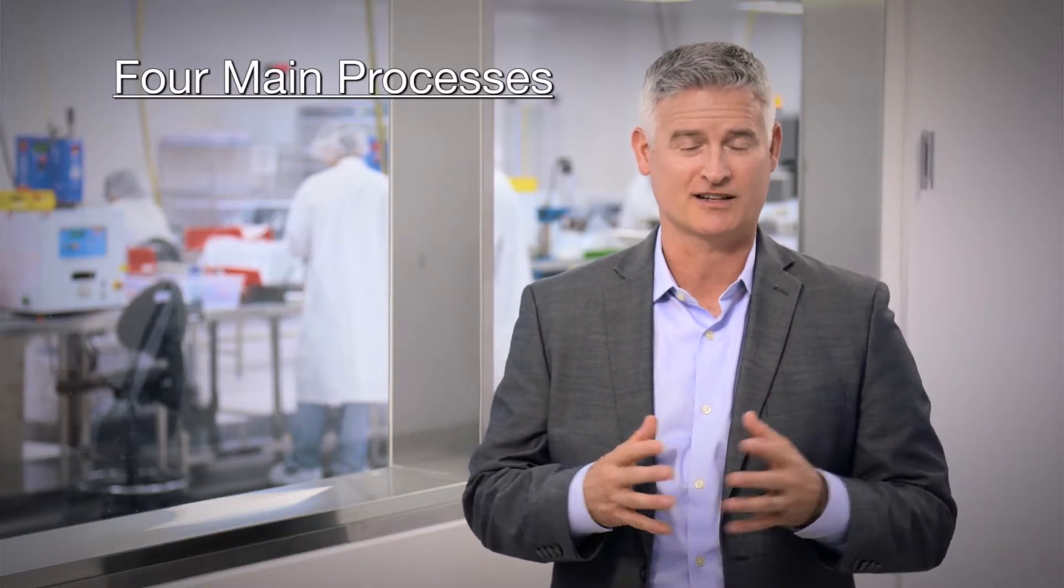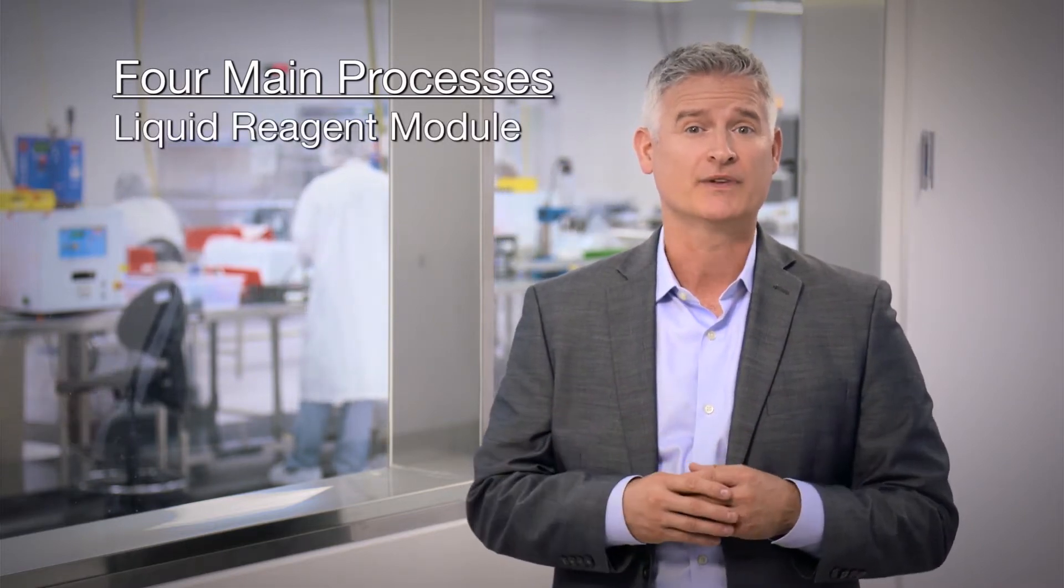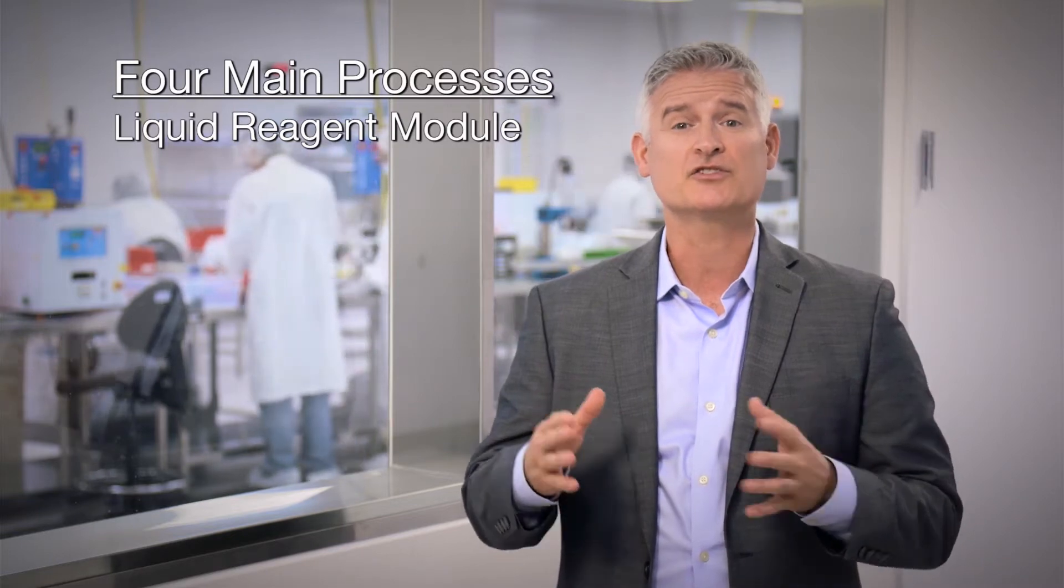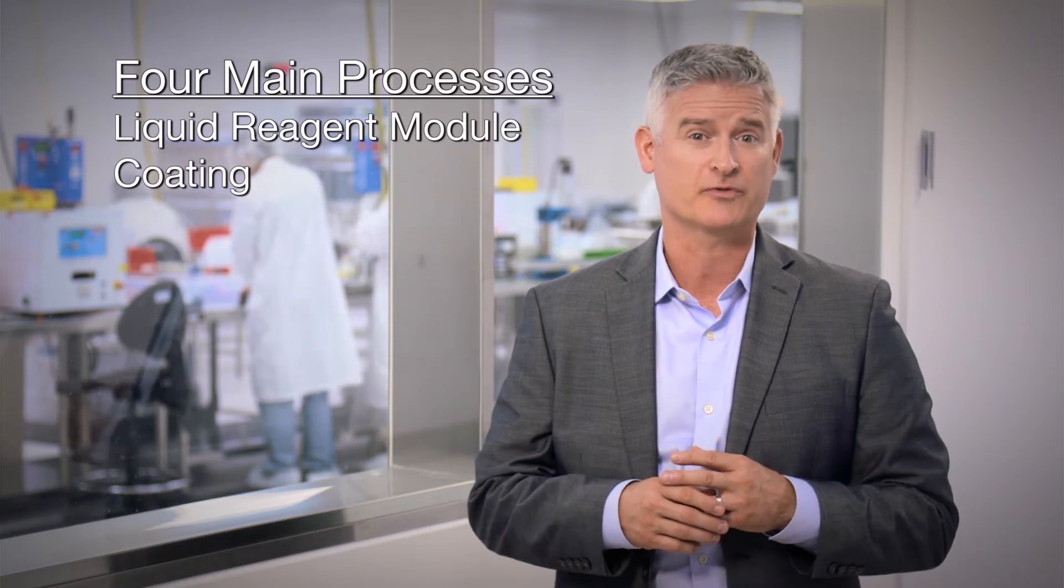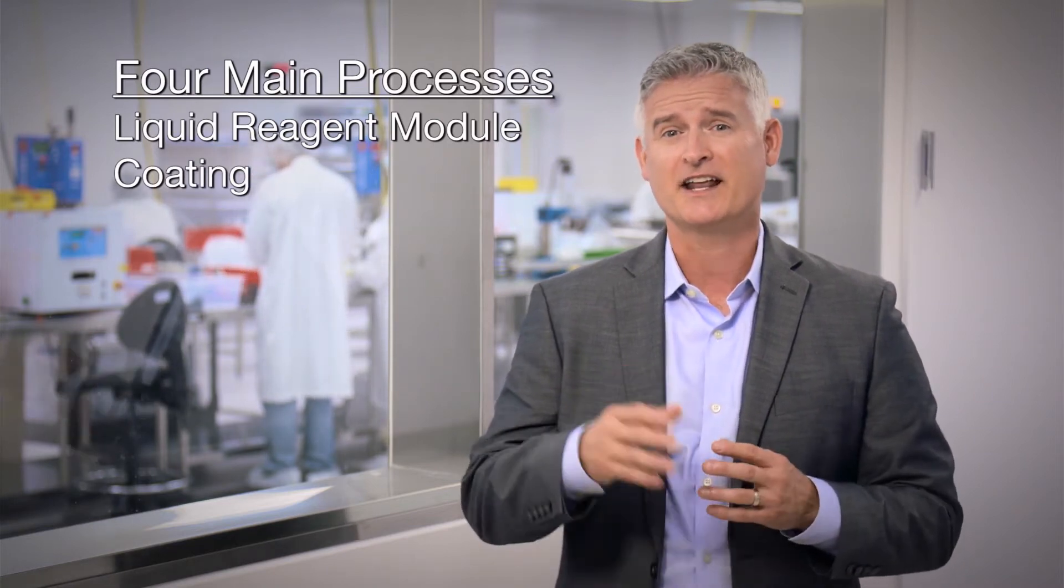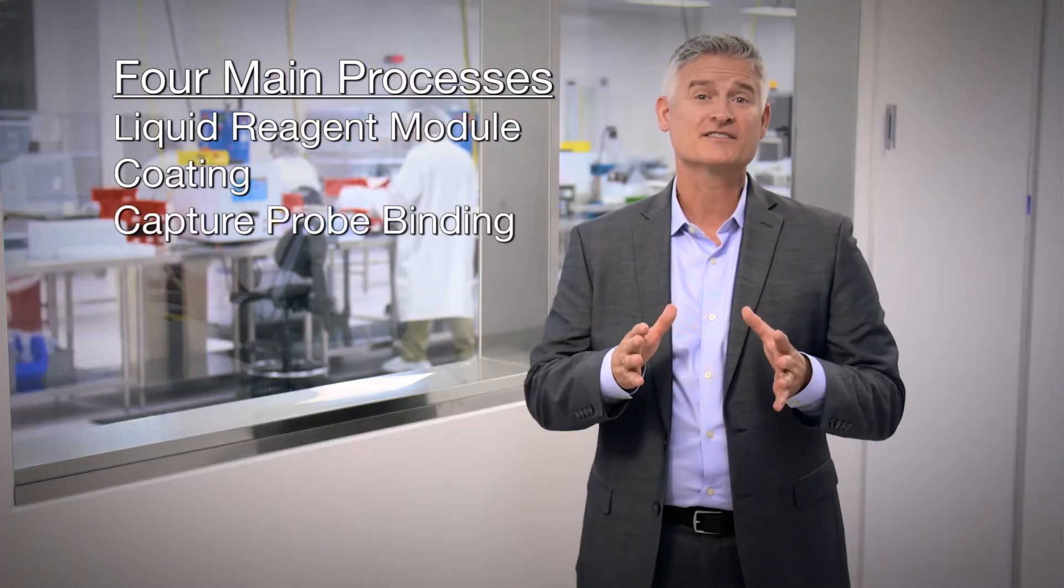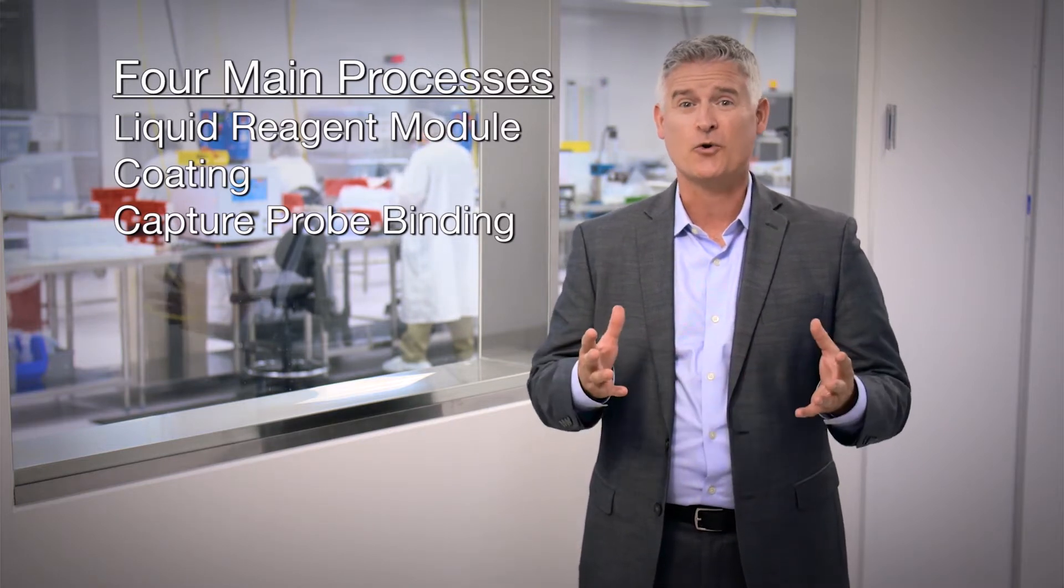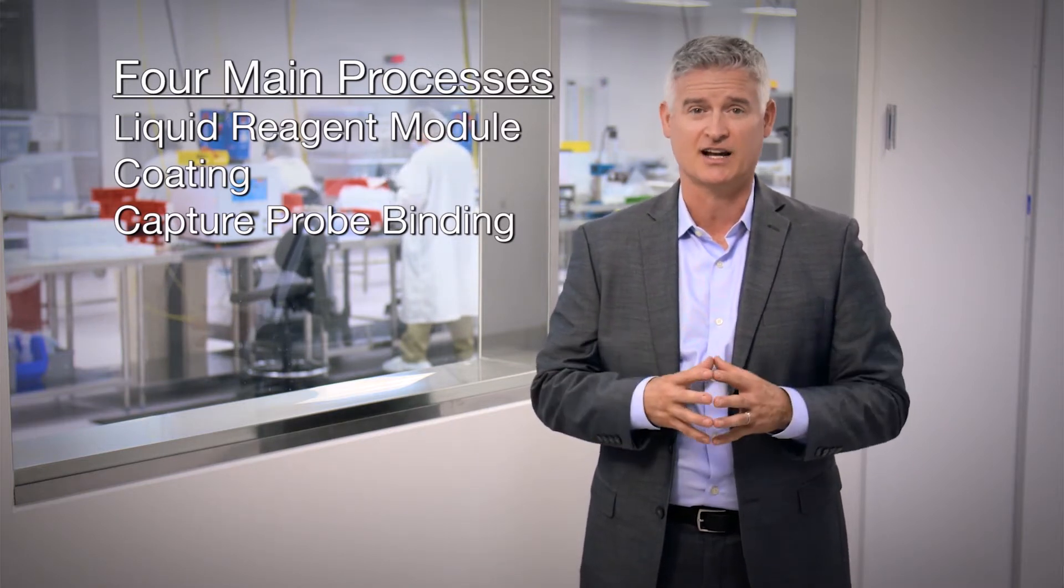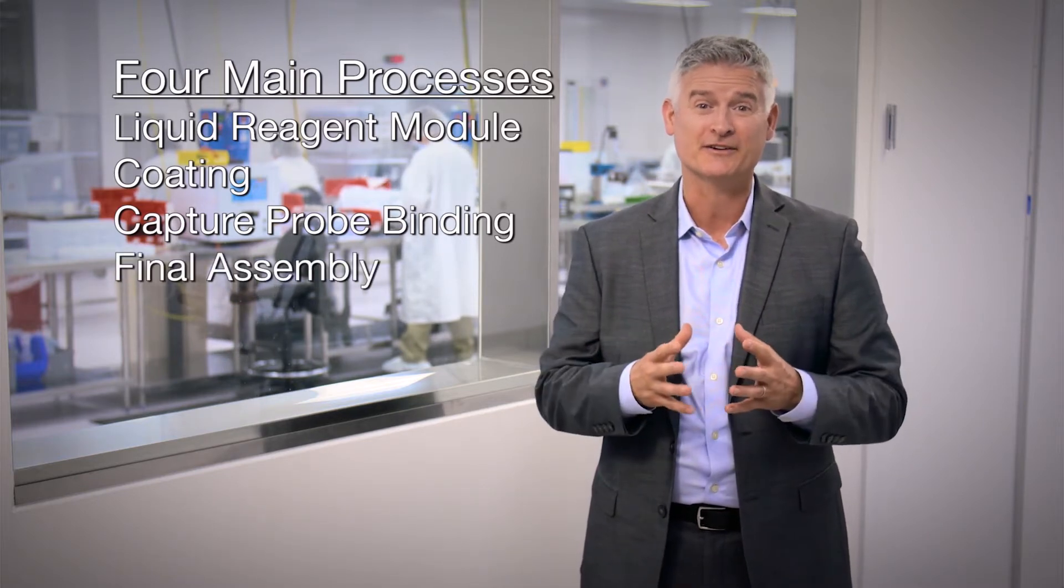As part of our tour today, we'll highlight four main subassembly processes. First is assembly of our liquid reagent module or LRM, that contains the liquid reagents used in all of our assays. Second is the coating of ePlex cartridge components for the Electrowetting Microfluidics technology that enables ePlex's sample-to-answer capability. Third is the binding of capture probes onto the electrodes of the printed circuit board, that is the core of Genmark's proprietary eSensor detection technology. And lastly, we'll show you how all these components come together in the final product.